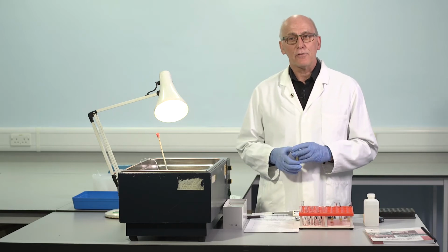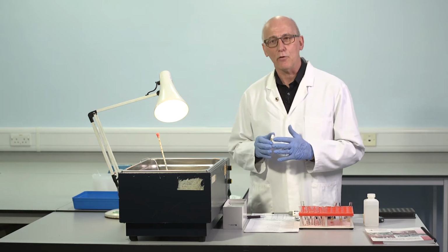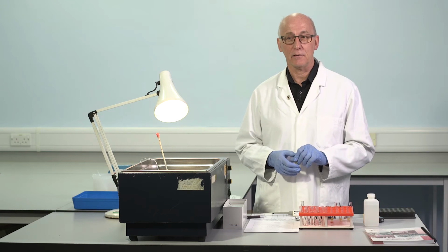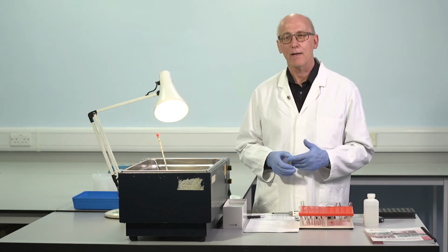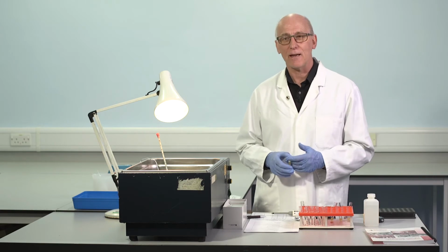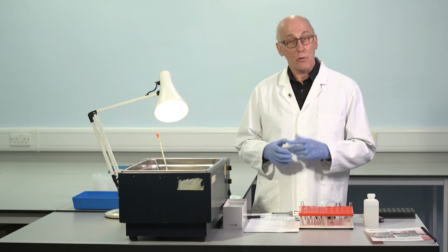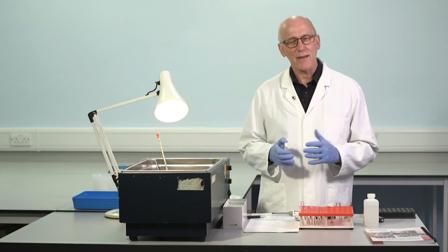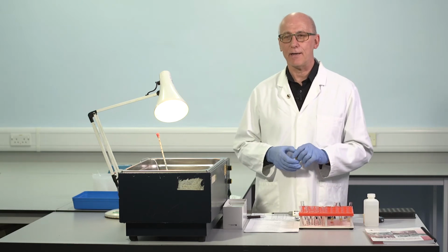So an advantage to a frozen sample for a quality control, we've not changed the properties so much. Freeze drying has the potential to introduce differences. We can change pH and so on, and it's necessary to take steps to prevent that. We don't need to do that in a frozen sample in the same way. The other advantage of a locally prepared internal quality control, a frozen material, to some extent we can select a particular level of factor VIII.